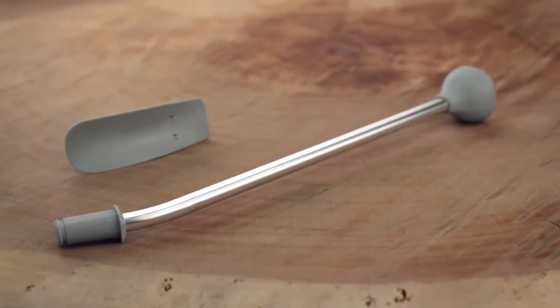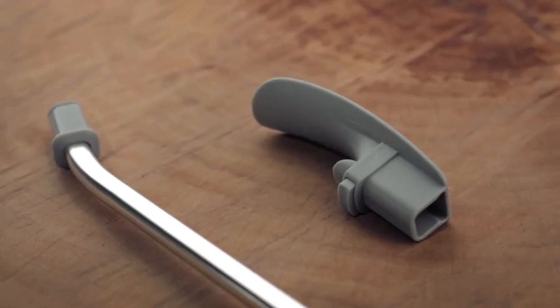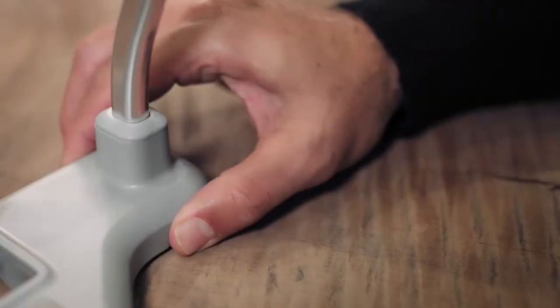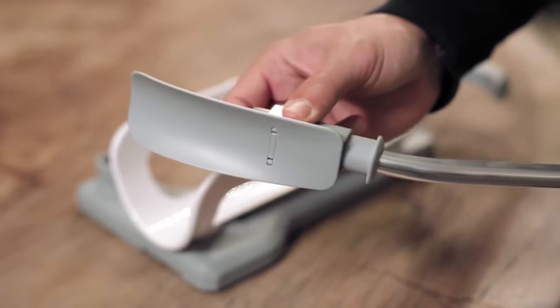Your kit includes a multi-function handle and special sock remover tip that can also be used as a shoe horn. Remove the handle from the Socky by pressing the button on the base. Attach the Socky tip until it clicks.